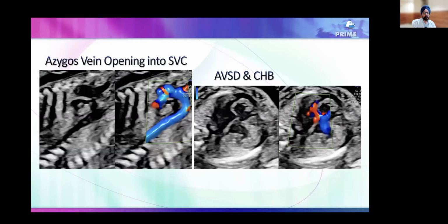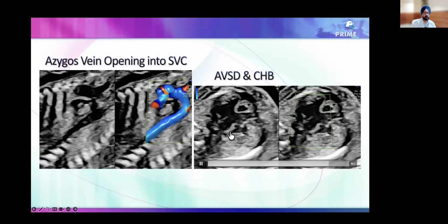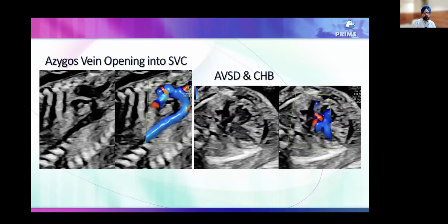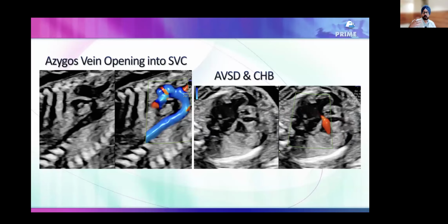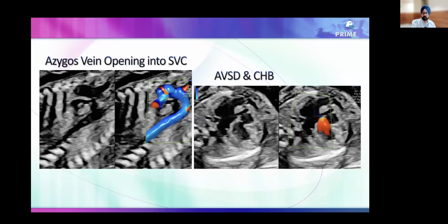Not really. Maybe you're right, but we're not sure which ventricle is right or left, because that's not an appropriate view. And that again is not an appropriate view to say whether this is non-compaction or not, because we are not truly at the apex. So this is a kind of an oblique view, like a short axis view of the LV.